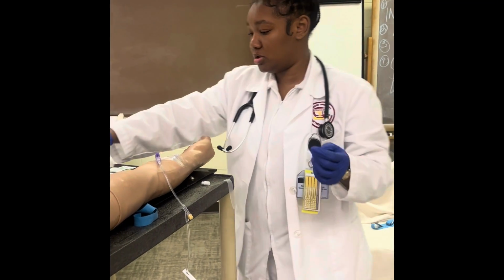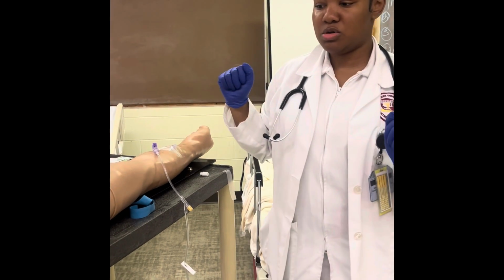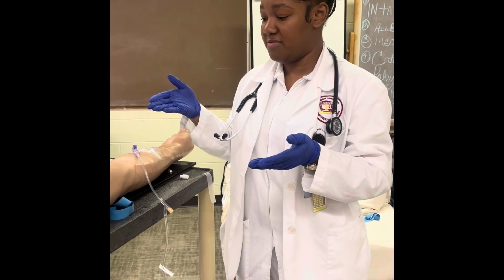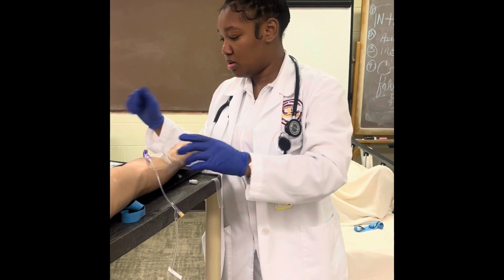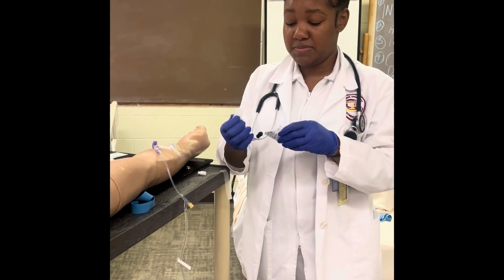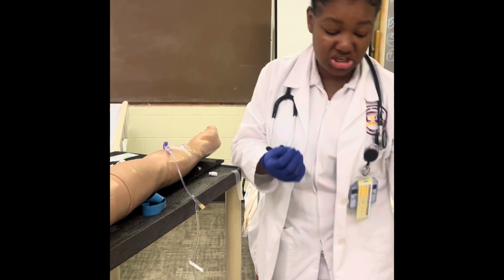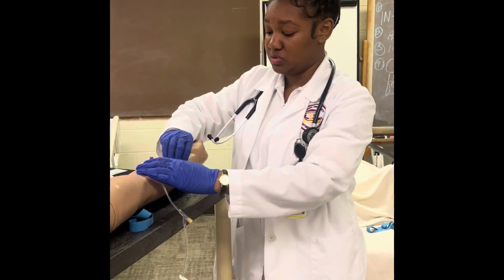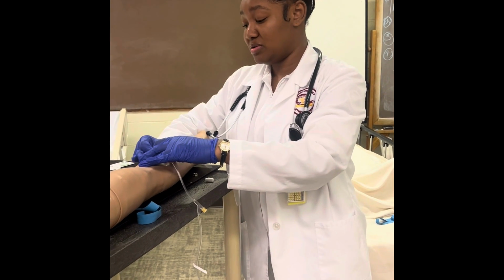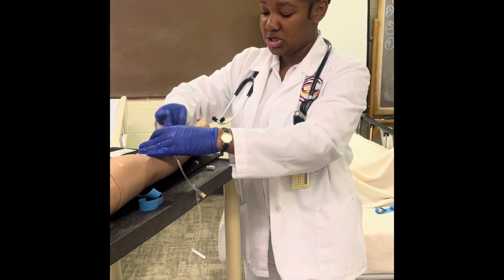And discard everything. Okay, the last thing I'm gonna do, my patient is done with all his medication and all his fluid, so I'm gonna discontinue my IV. Depending on how long the tape has been on here, and the bandages have been on the patient, it can be really sticky and hard to remove. So I'm gonna use some alcohol to loosen up the tape so it can be as comfortable as possible for the patient.